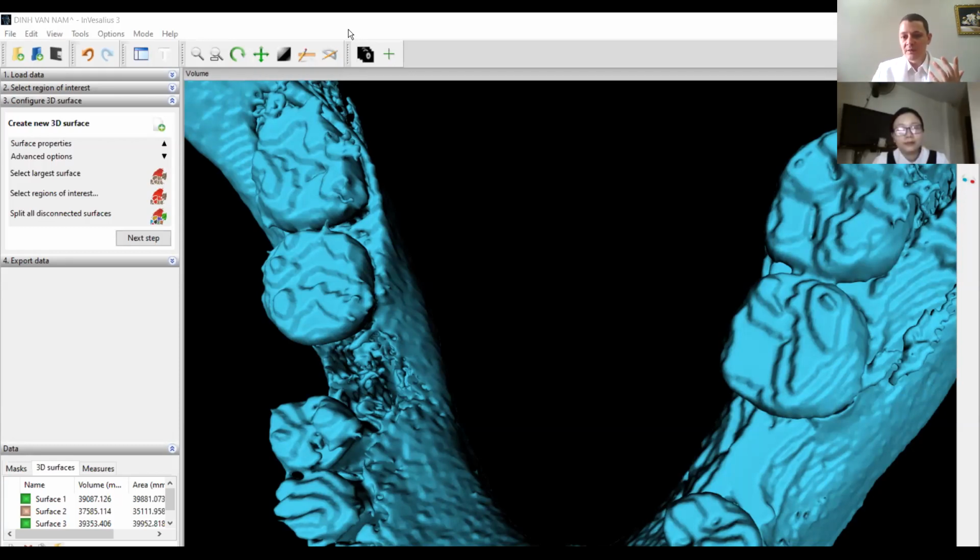So what I am doing in this case is either I remove the 7, so I can move the 6 back and the 8 forward, or if the patient doesn't have the 8, I remove the 5. But you have to remove something.